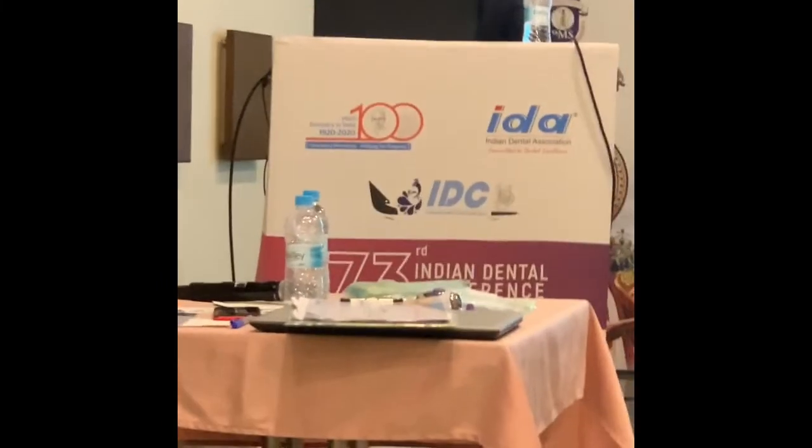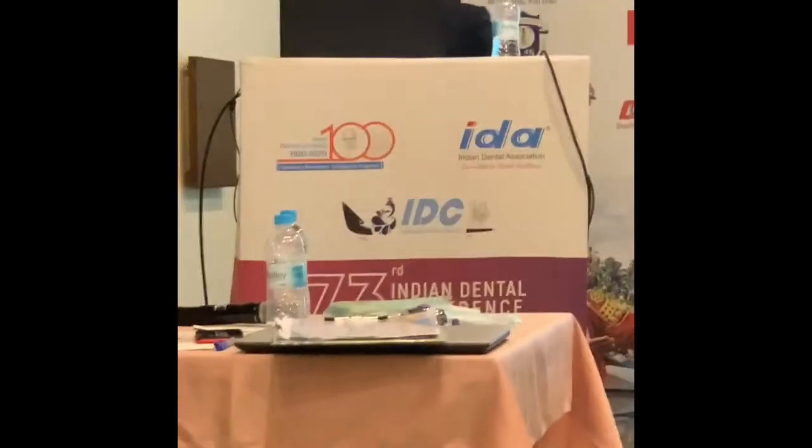The simple concept in implant is the tooth which you are going to replace. You think if it is a molar, for example, you choose an implant according to that. Of course, you should have enough bone width and height for that. But normally, a molar is going to be wider, so you can go for a 5 mm diameter implant, and the length in the molar region is going to be a little short, 10 mm. If the nerve is close, the next thing.